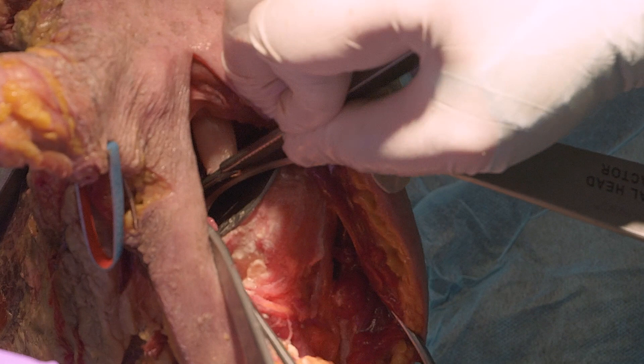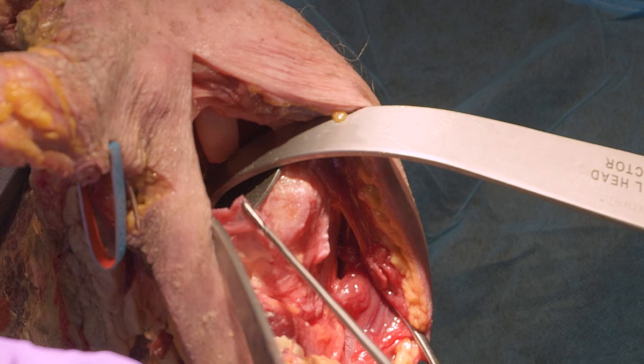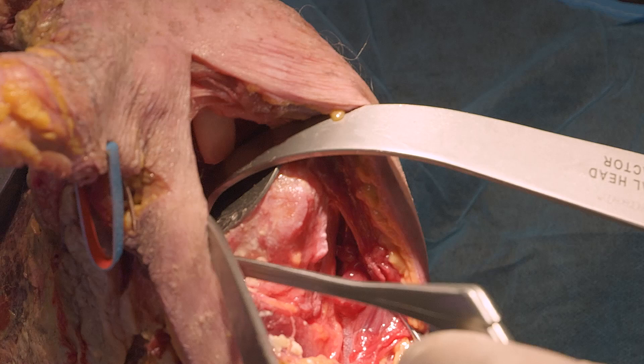This is showing resection of the labrum, which I typically do 360 degrees around the glenoid to get adequate exposure. The next step is resection of the biceps tendon, which also helps get the posterior and superior labrum, improving movement of the humerus posteriorly for adequate glenoid exposure.